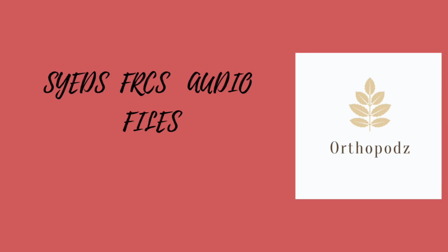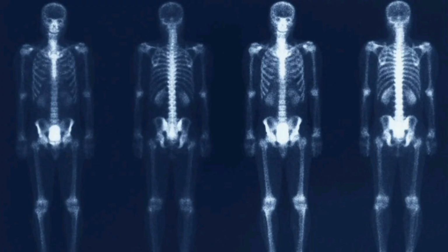Bone scan. So bone scan is imaging that detects distribution of injected radioisotope on a camera sensitive to emitted gamma X-rays and assesses the bone turnover. In orthopedics, normally we use technetium-99 MDP. MDP has the affinity to osteoblast and bone turnover.